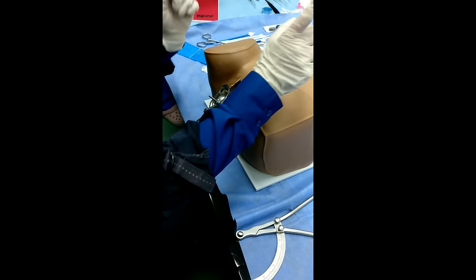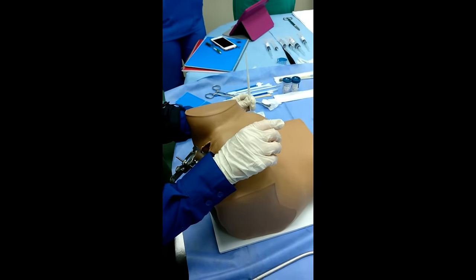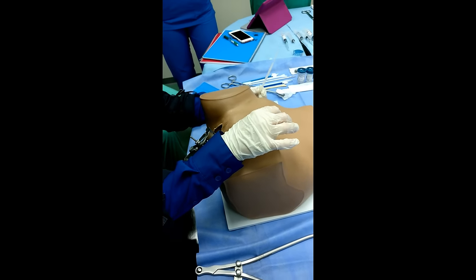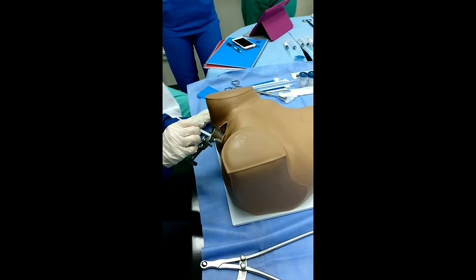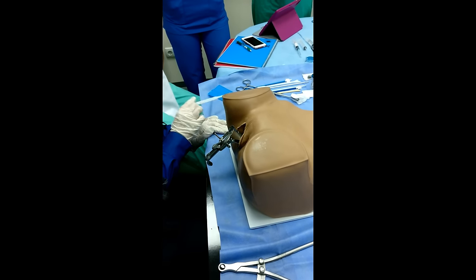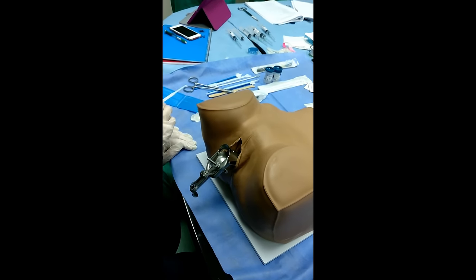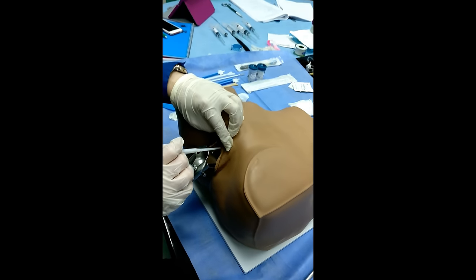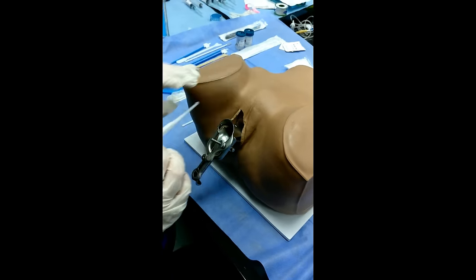For bacterioscopical exam on glasses, we must collect the material from the posterior vaginal fornix, cervical canal, and urethra, and we apply on three glasses. So from the posterior vaginal fornix, we apply on the glass. We change the end from the cervical canal, we apply on the glass. And from the urethral meatus, the urethra is here.